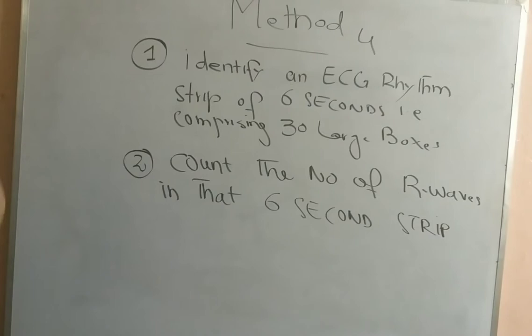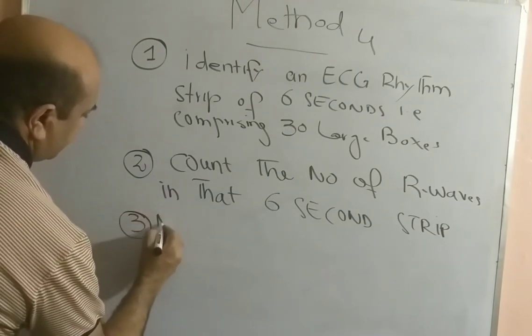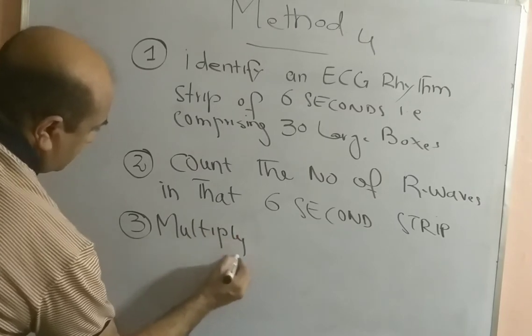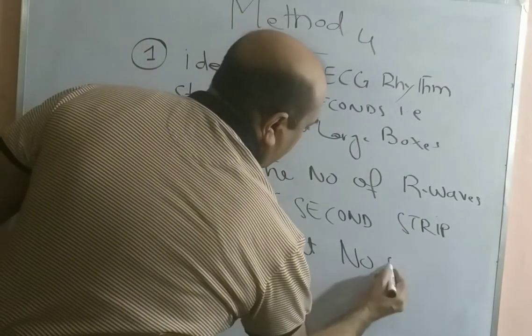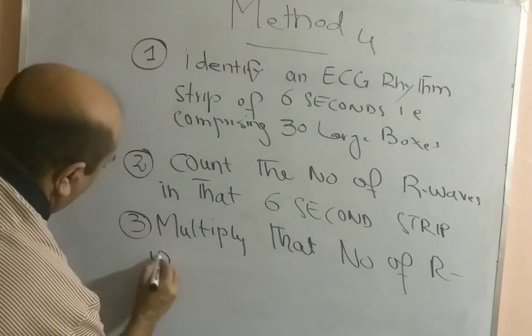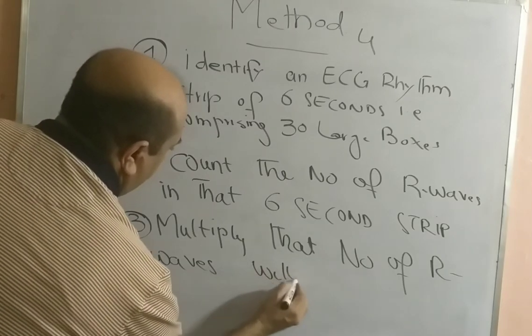Okay, this is step 2. Step 3, multiply that number of R waves with 10.